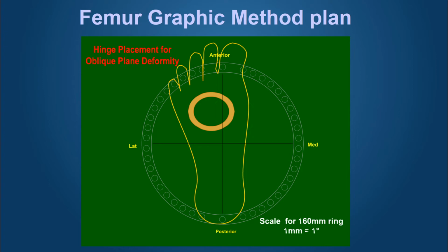When it's extended into the concavity, the white line shows us the motor rod position, and the purple line shows us how we can correct it using an opening wedge. The purple line, which is perpendicular to the white line, shows us where to place the hinges in order to get an accurate correction using an opening wedge method. If we wanted to use a neutral wedge correction, we would use the blue line, and if we wanted to perform shortening, we would use the red line.